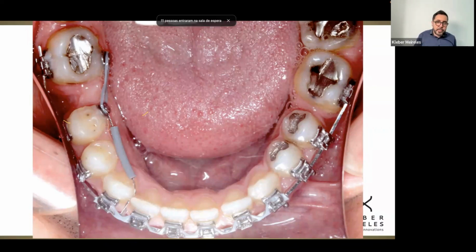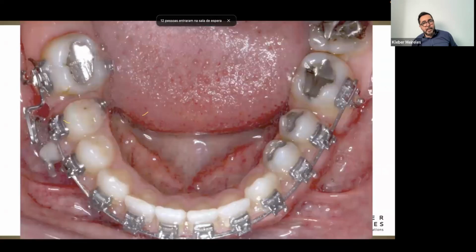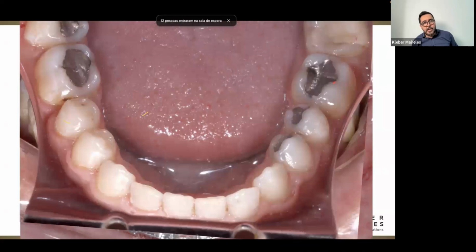Of course, this force here is being applied at the level of the crown and is generating inclination, meaning in the lateral view, it would be the angulation of the crown, but again, we need to adjust. Let's see, regarding the rotation, what's going on? You see here, closing the gap. Okay, let's move it back. Closing the gap, and closing the gap. You see it? So we managed to have a good movement just using the concept of one line of action.